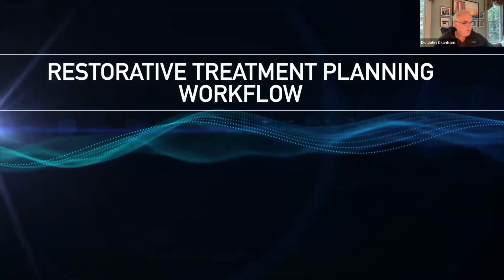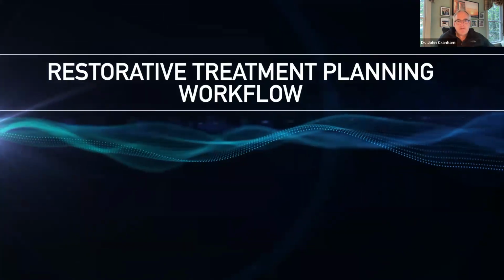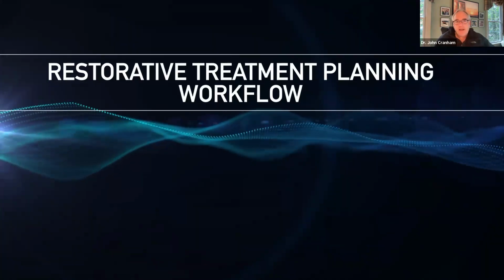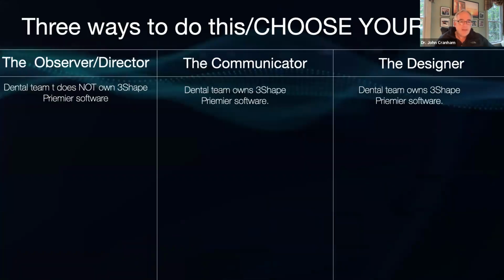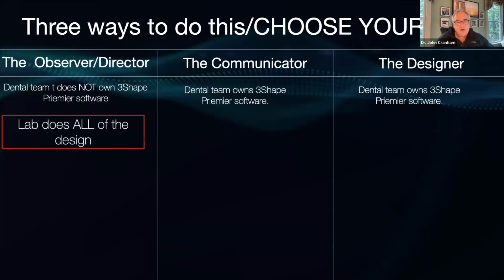Let's look at just a sample restorative workflow and talk about the different ways that we can use this software, whether we're going to work on it ourselves or we're going to work with a lab. I have doctors working one of three ways with the 3Shape software, where they may obtain the scans and they may fill out the forms that we recommend to communicate to the lab. So in this case, the dentist wouldn't own the software, but they would refer out and direct the wax ups to be done. And so in type 1, the lab does all the design.